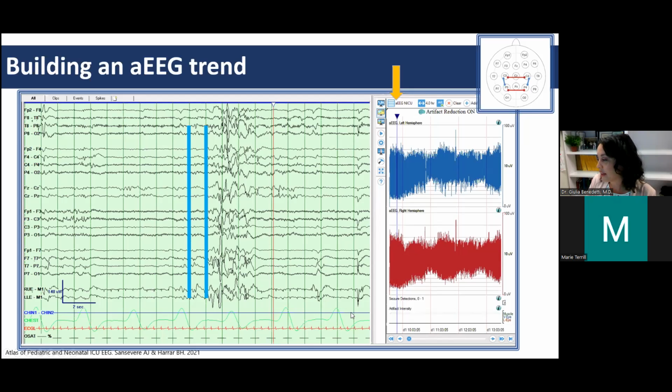You can plot the trends over time, condensed over a long period, and then you have amplitude on a logarithmic scale on the y-axis. The way this works is you take a specific epoch of time, like 1 second here, and you plot the minimum amplitude and the maximum amplitude in that epoch. You plot it as a vertical line with the minimum and maximum. Then you go to the next second and you plot the minimum and maximum, and you get this stack of thousands of little bars.